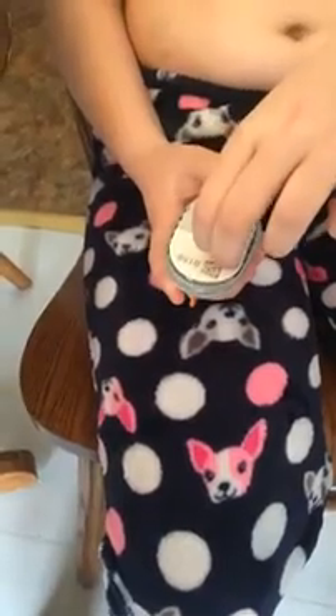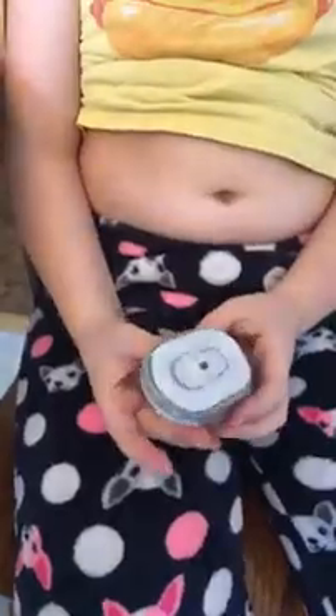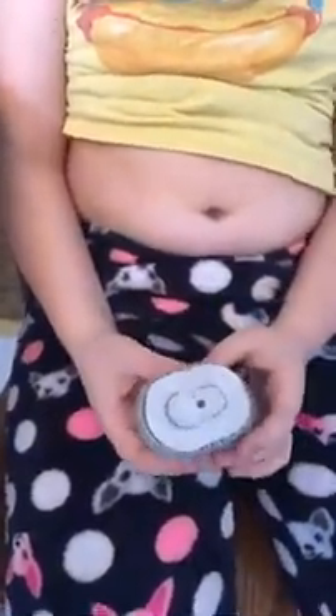We have used generic Flonase on reaction sites. All you do is peel those two flaps off and take off the guard or the button. Don't put your finger on the button. She's still not comfortable with holding this herself. So we're going to put it right there — just press it, stick it on.